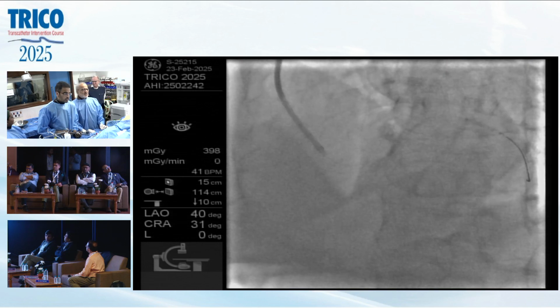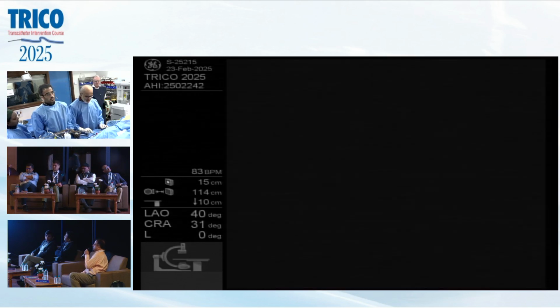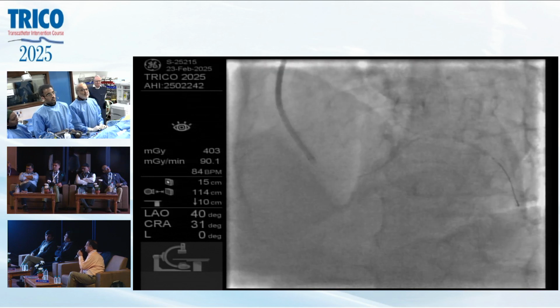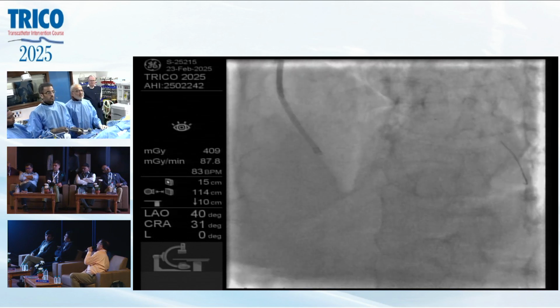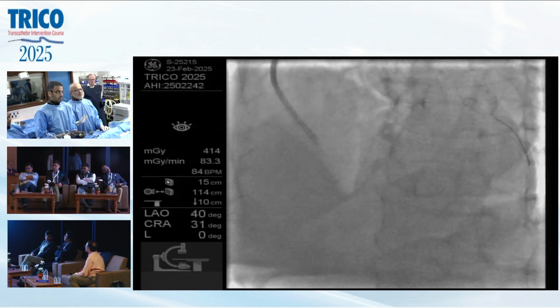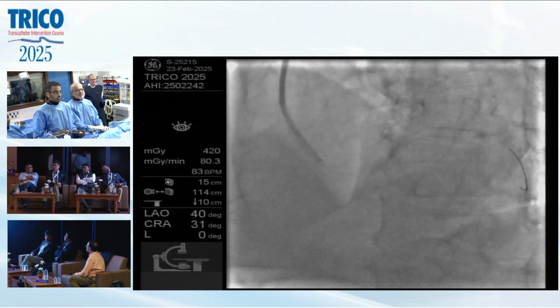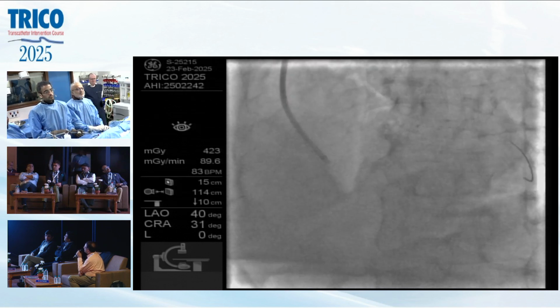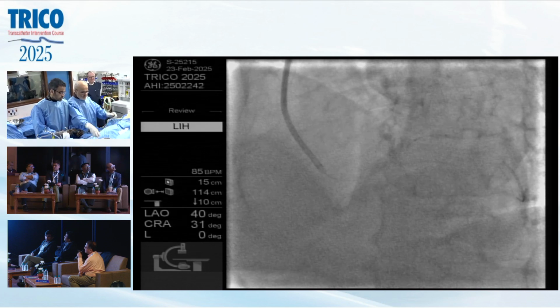Sanjay says that you deploy another wire just to make sure that guide catheter alignment remains perfect. What do you think? It's not a bad idea. I think it'll stabilize your system. That's a good idea. Same wire, go up. Same wire which we have put in RCA, we can 6, 8. Deflate. Yeah, because the catheter does seem to have a little torque build up on it. Yes, there's some energy in it.